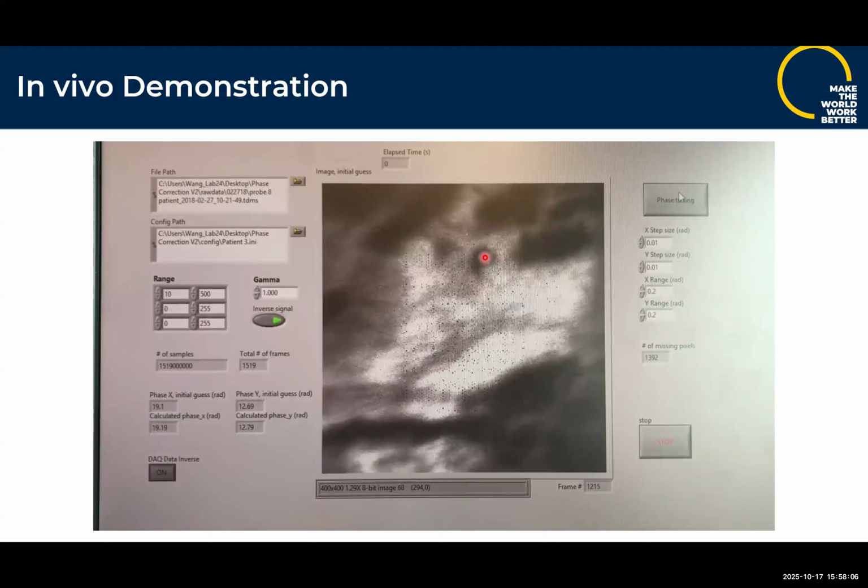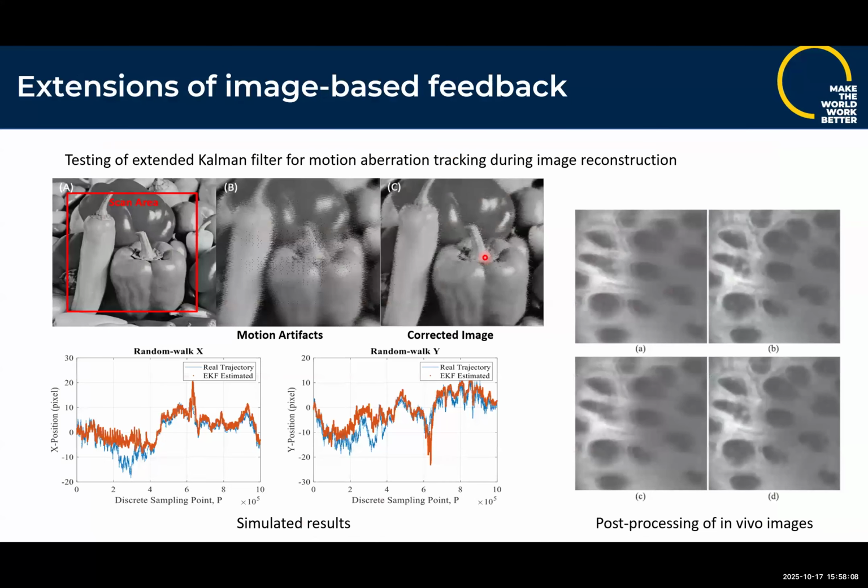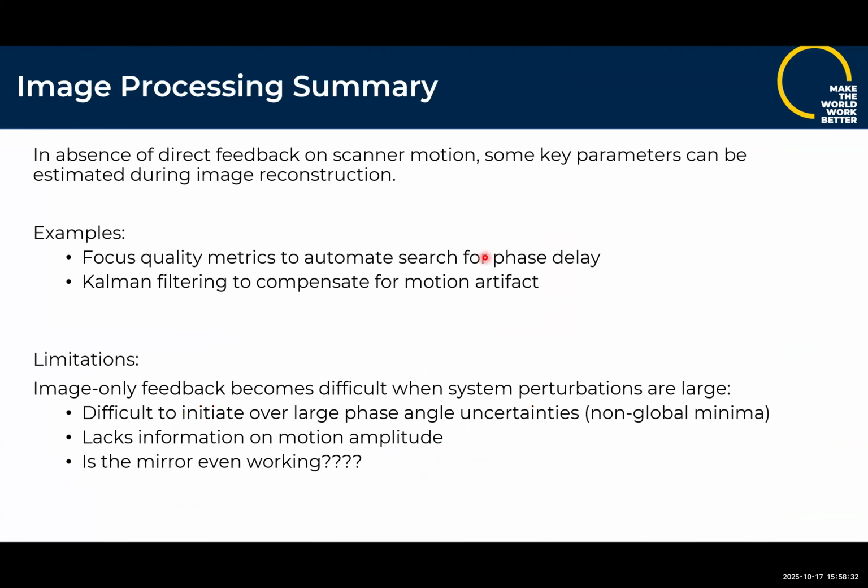And so we use this quite a lot these days. And we've played with other extensions. You can see that there's a lot of blur anytime you're moving the instrument. We've played with extensions for trying to track changes, track the motion aberrations with this as we go along. They work well in simulation, though in practice the motions are too abrupt even for doing that, although Do and Tsai, one of the other members of the Imaging Center, is working on that as well.